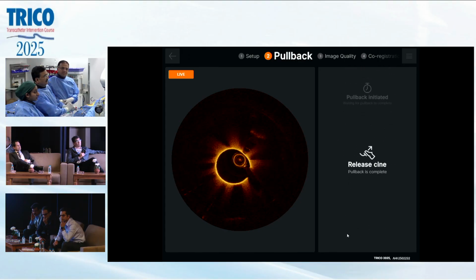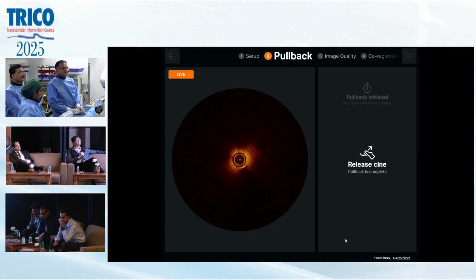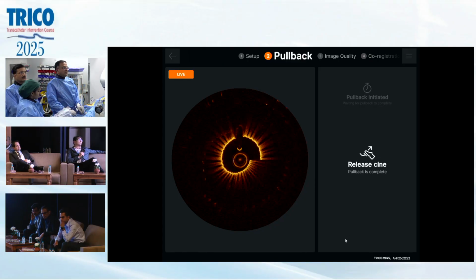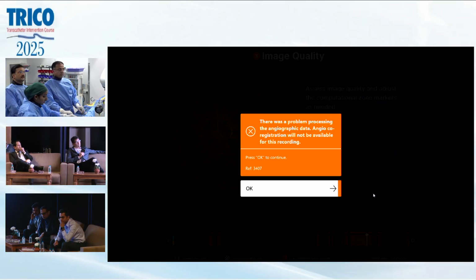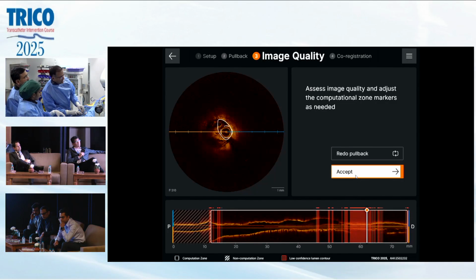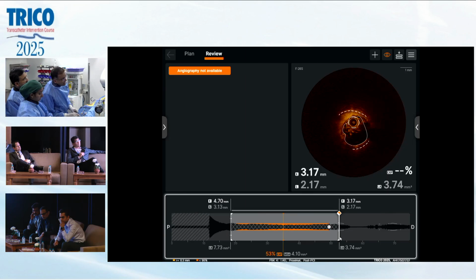Okay, that should be decent. Then you again keep it in. See the OCT.